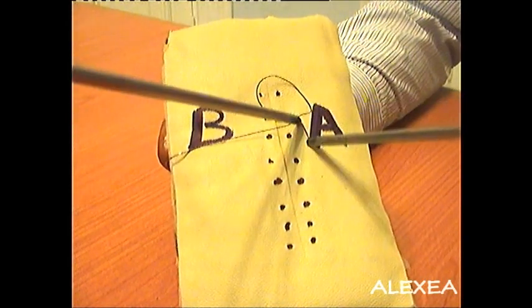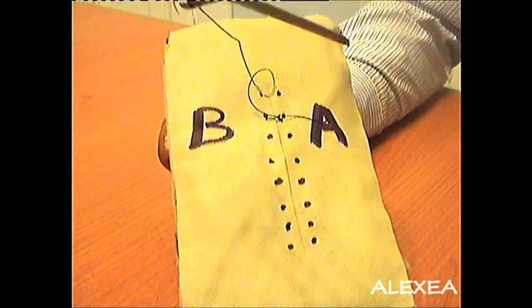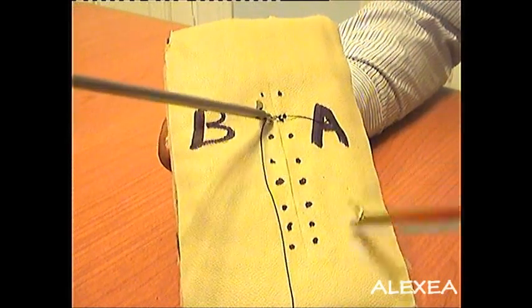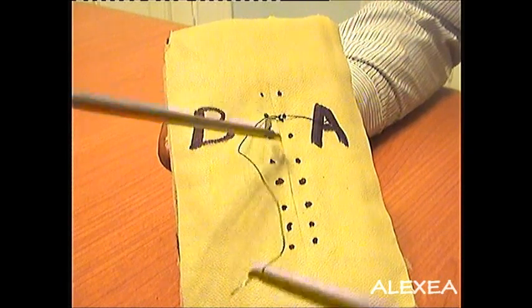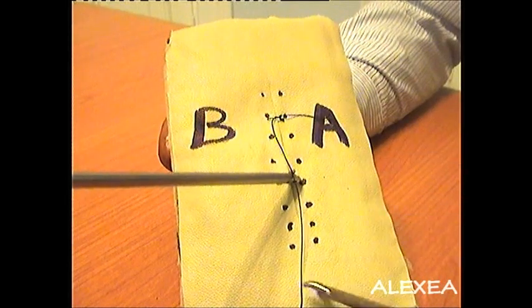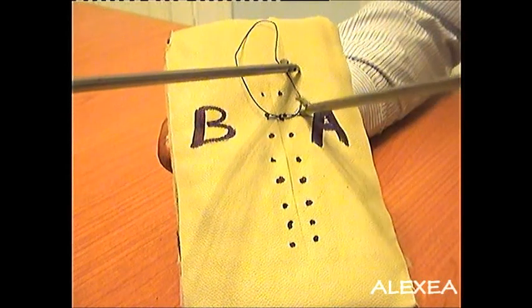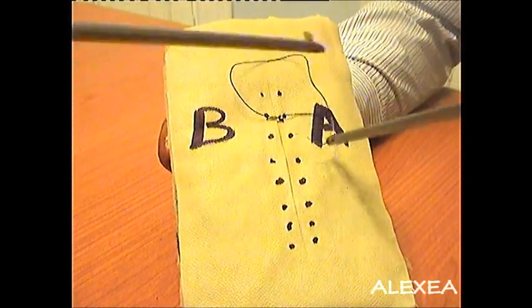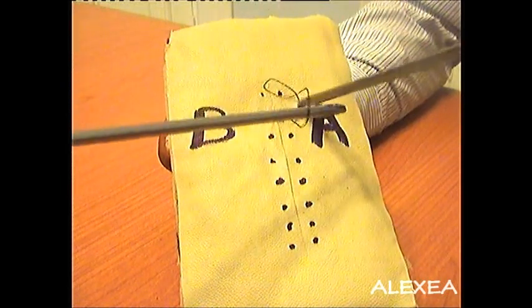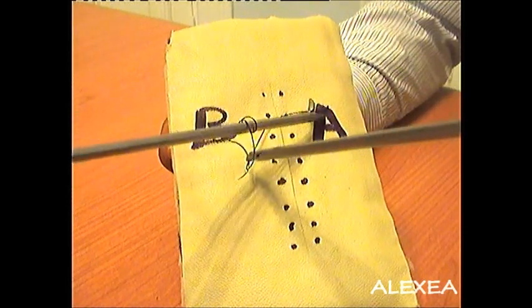In planning knot number 3, take this needle on the side of side A, hold the tip. Holding the needle tip is extremely important in the exercise. Hold the needle tip and prepare knot number 3. 1, take it far away. 2, take it far away and grab the shorter end.